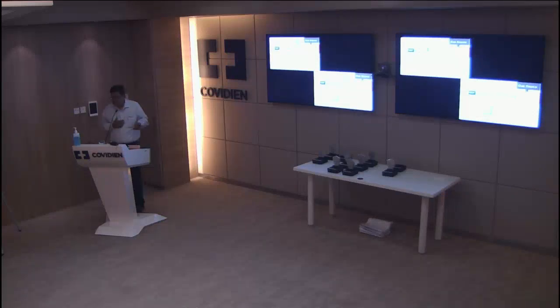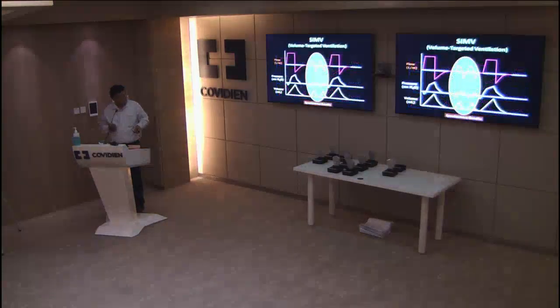Then they had something called synchronized intermittent mandatory ventilation, or SIMV, which still is very, very popular, especially with anesthetists for some reason. I don't know why, but it's a very popular mode with most anesthetists who run ICUs. The whole thing was that they have these mandatory breaths and they try to synchronize the patient's own breathing with the mandatory breath. So if the patient is not breathing, then he gets the mandatory breaths. But if for some reason the patient makes a breath, they try and match the patient's breathing with the mandatory breath. So there is no clash between the patient's breathing and the ventilator. That is the whole premise of SIMV.